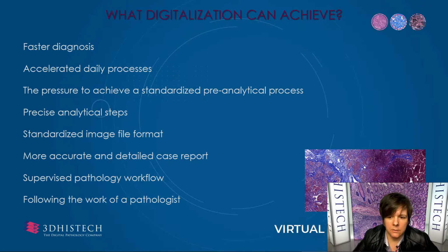Digitalization is not an easy step, especially if we consider the challenges of the scanning operation. The quality of the prepared slides depends on the pre-analytical phase, which has no standardization, but digitalization will be able to initiate the increasing quality of the tissue section preparations.